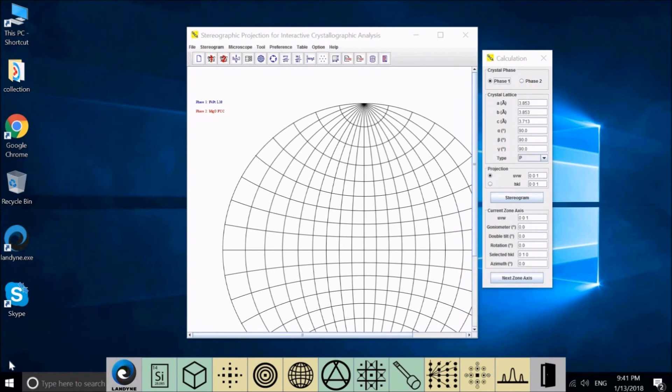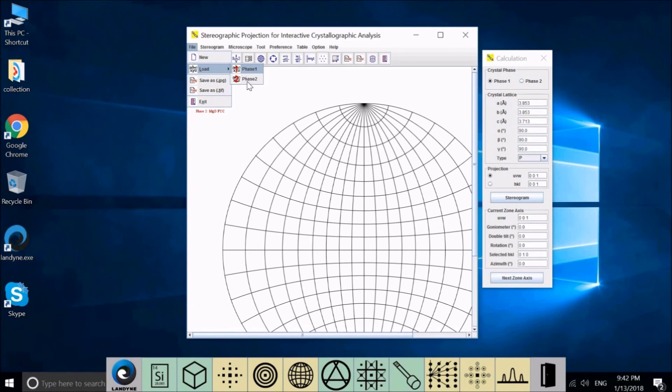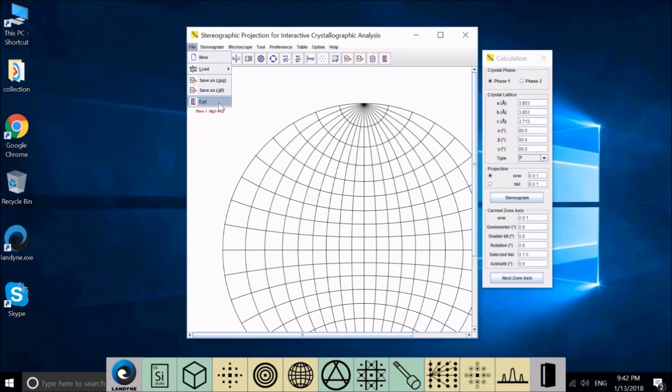Let me briefly introduce the functions on the menu first, and then go to details with examples. First, let's check File. The first one, New, is for you to prepare new structure file. You may load two structure files in the program as phase 1 and phase 2, and you can save the display as JPEG or TIFF file. Exit, leave the program.